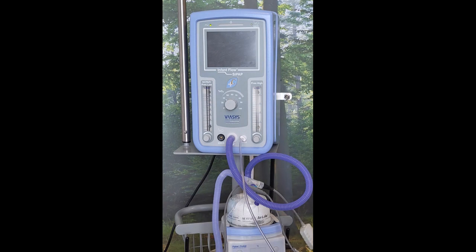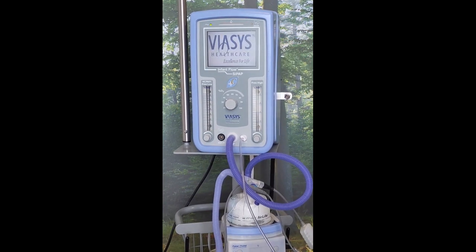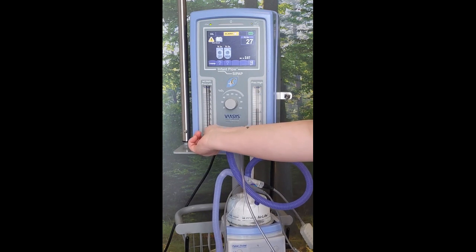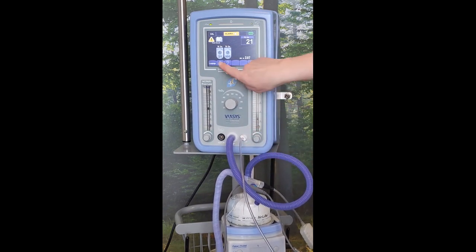Now that you've set up all your tubing, the next thing is to calibrate the machine. We start by turning on the switches located at the back of the machine. In order to calibrate, first push the calibrate button. Turn the oxygen to 21%, turn our low pressure to 9 and our high pressure between 2 and 3. Once we've done that, push the question mark. The timer will come up and we wait for a green tick.